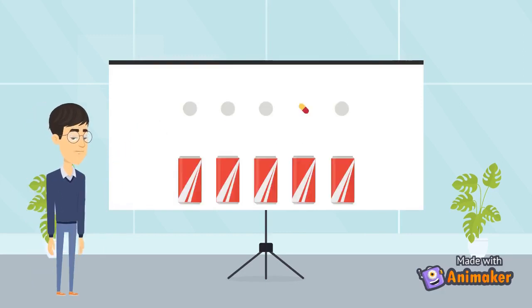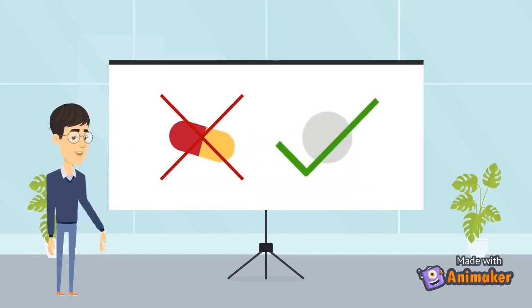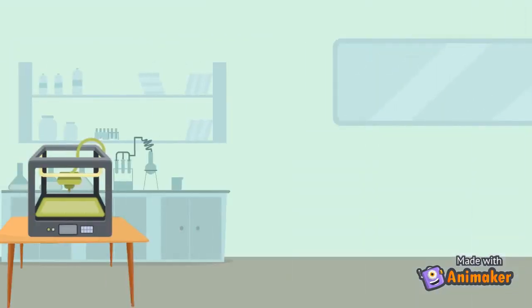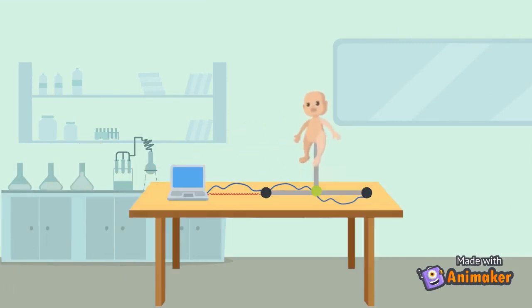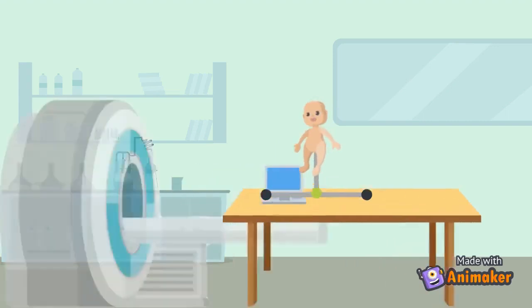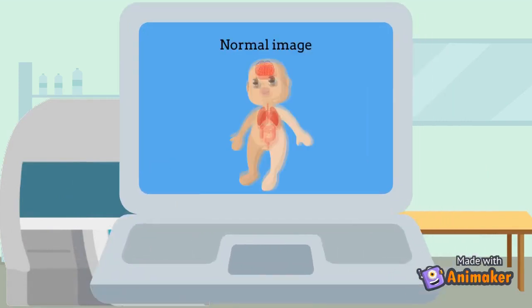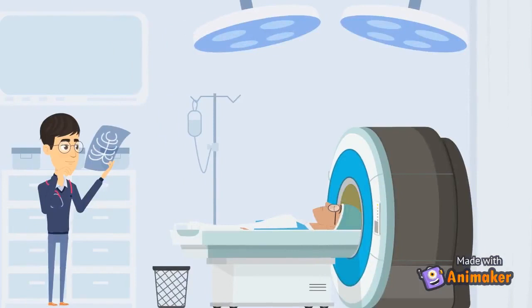Now, for all experiments, if you do it once, you must be able to replicate the results. However, fetal motion is erratic and cannot be replicated. Since a natural fetus can't be used, we can use my research to 3D print one of our own using synthetic materials. We can then make a robot to move the artificial fetus in a physiological motion pattern. This ensures the motion is reproducible, allowing for sequence optimization. The sequences developed from the artificial fetus can then be used on a natural fetus to produce clearer images.